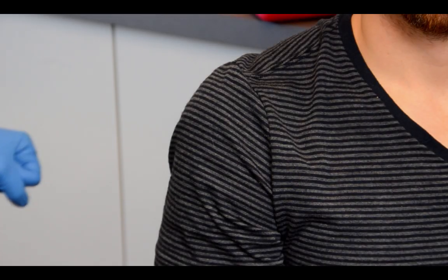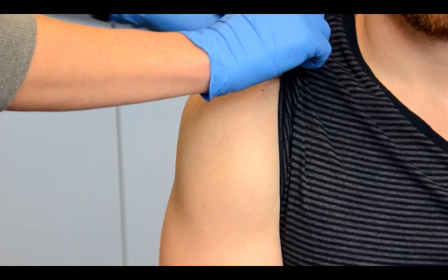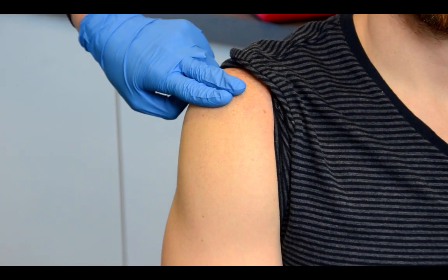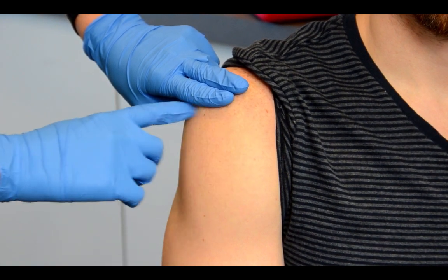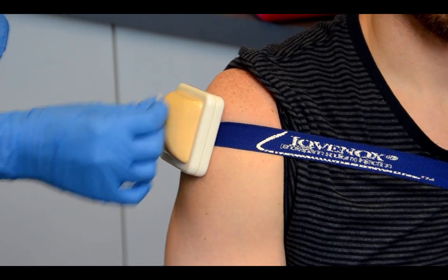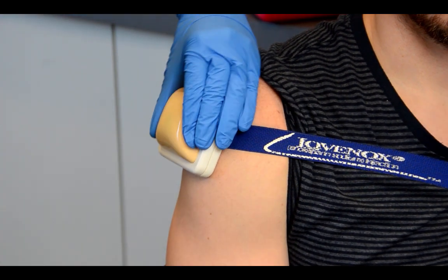Today I'll demonstrate how to give a dose of injectable naloxone in a patient's deltoid muscle. When giving an intramuscular injection, you'll first remove the patient's clothing to expose the skin. Feel for the bony edge of the patient's shoulder. Place two fingers beneath that — the triangular area here is the deltoid muscle and that's where you'll be giving the injection. If available, clean the area with an alcohol swab.